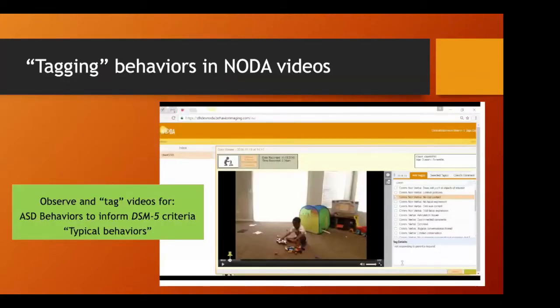So this is a picture of the NODA video dashboard that you will see as a clinician. As you're watching these, typically around 10-minute video snippets, you'll see a little pin at the bottom on the scroll bar of the video. That pin indicates that there was a behavior happening in the video that was significant for some reason.